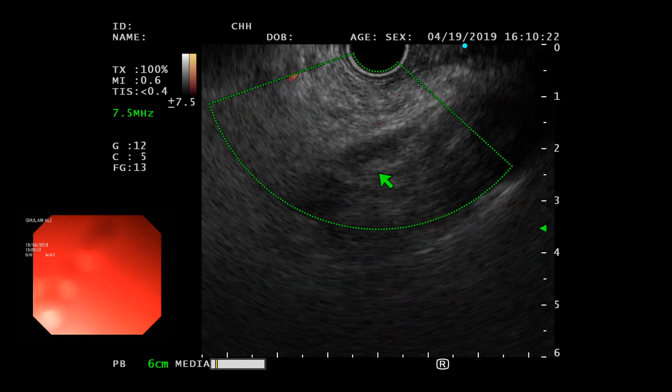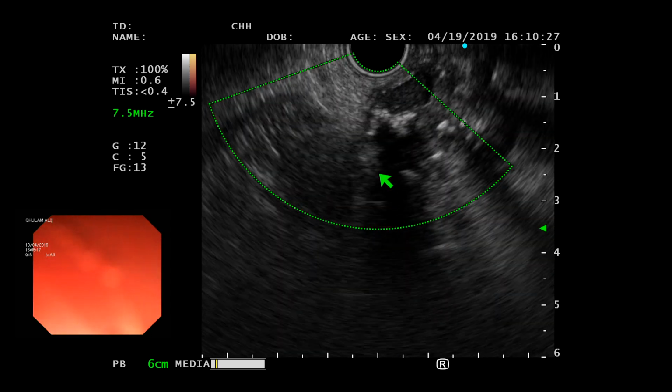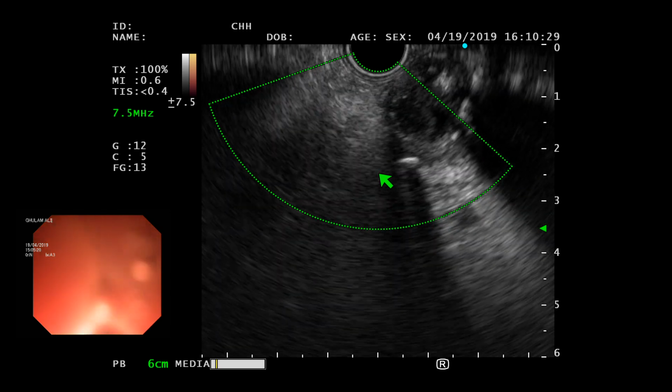That's a left adrenal, by the way. So I have to push. It's very gentle. You have to be gentle. Pushing is. Khalid sir, will you remove the Doppler?